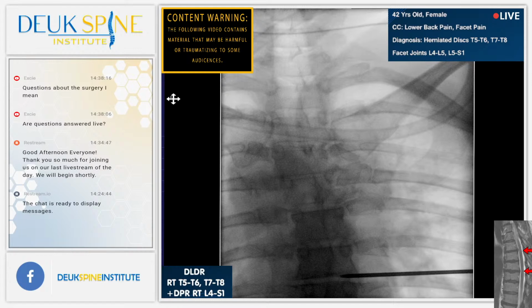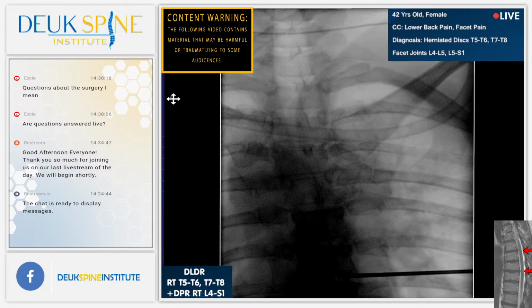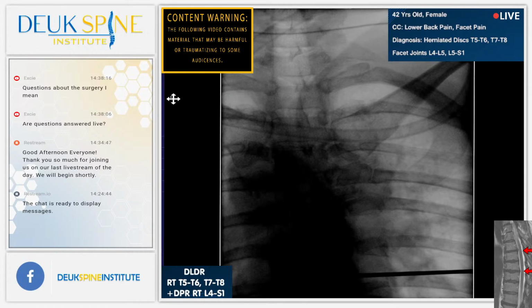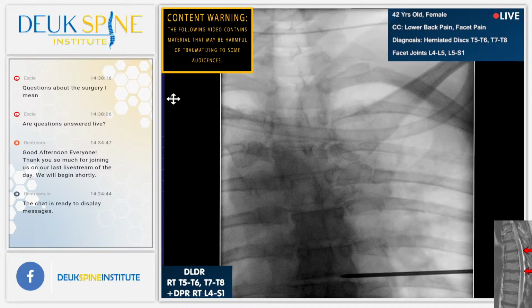Did you guys see the counting there? Yes, we did. So counting is very difficult in the thoracic spine. And we're counting from top down and bottom up. We're doing it both ways. You're really supposed to count obviously either top down or bottom up, but I like to do both. That way you can confirm. No, you got to take a better picture. You're going to have to go further north if you can, but I want to clearly see the T1 rib.